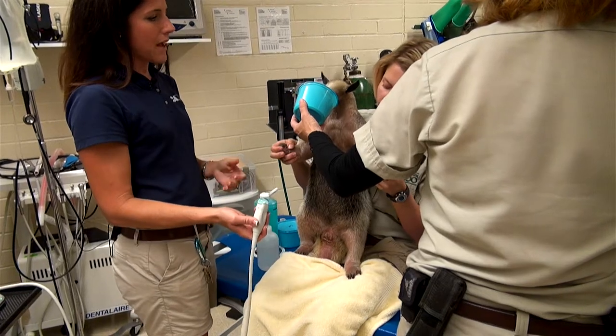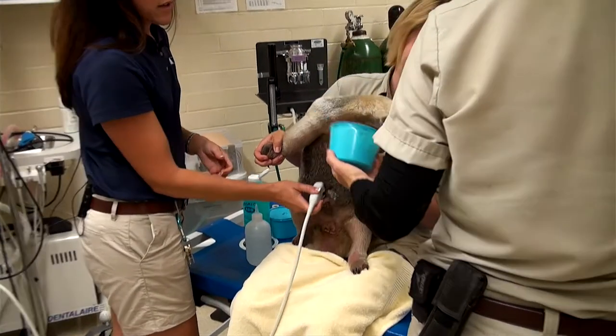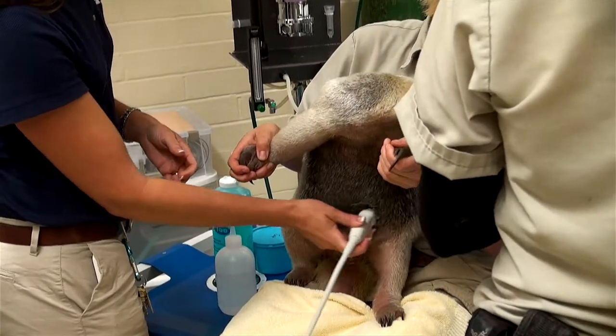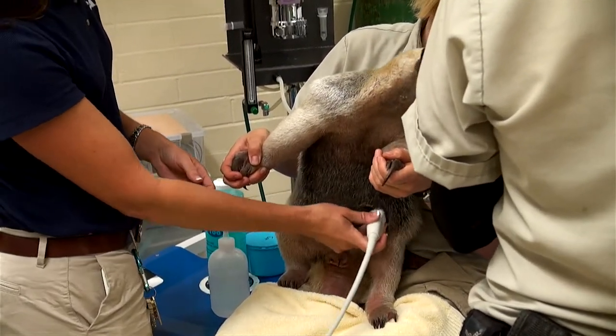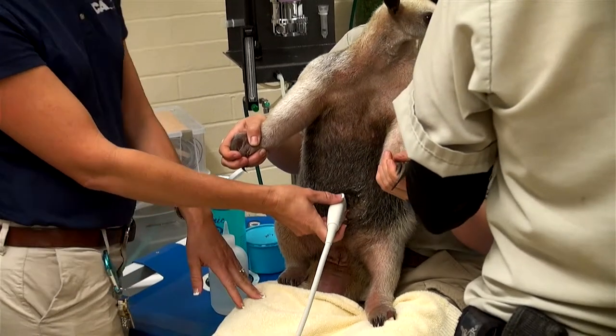They're positioned in the lap and they voluntarily participate for this with food. What I do first is I put a little bit of alcohol on their belly, and then I use a little bit of ultrasound jelly.